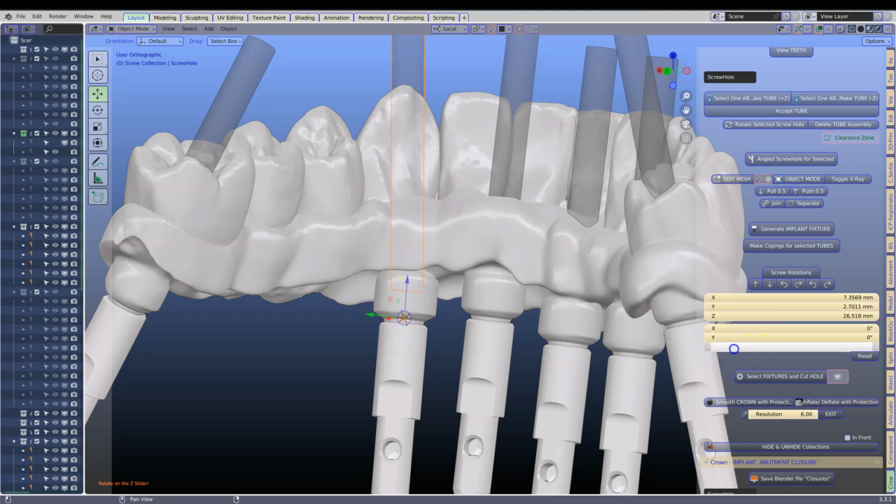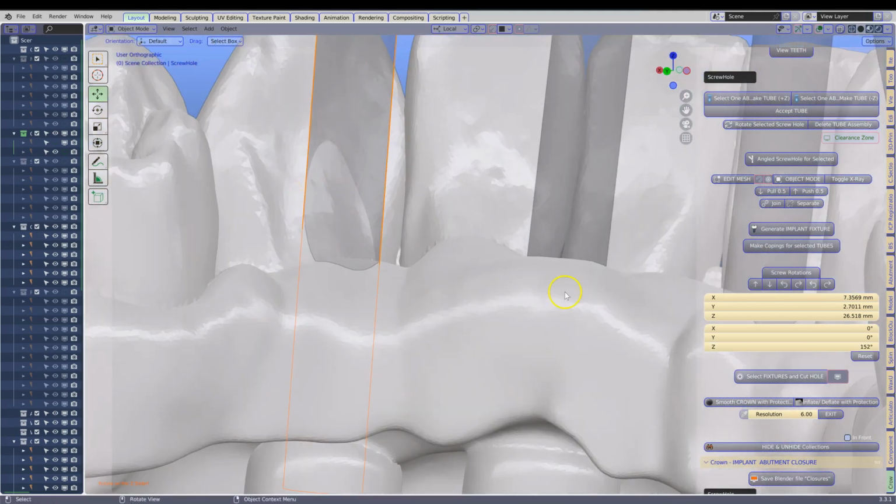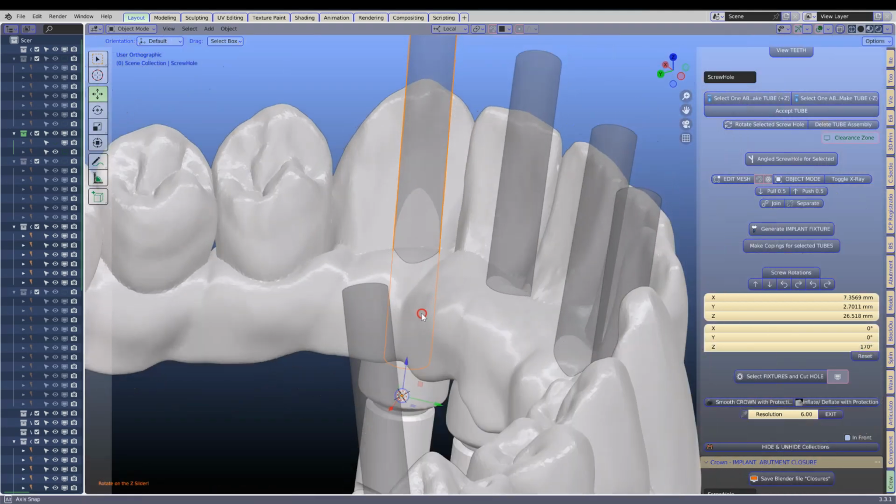Now in the Z, I'm going to drag it and slide the Z here. You can see on the right hand side. I'm going to place this so that I get a good position for my screw to come through. I don't want it there, so I'm looking at something perhaps over here like that.